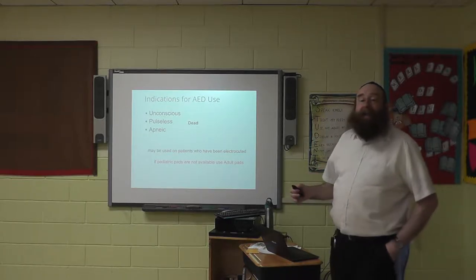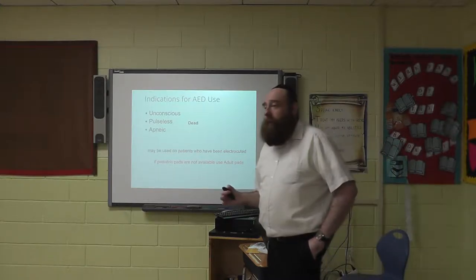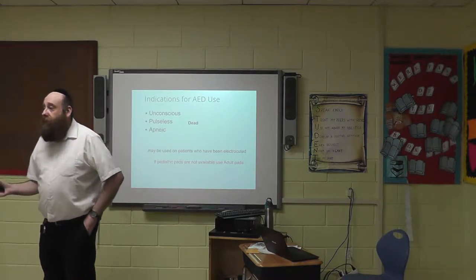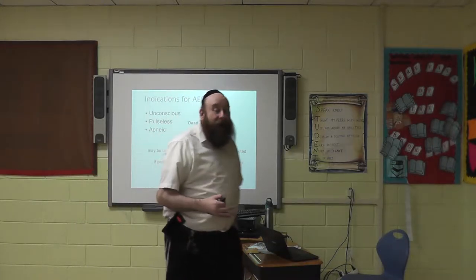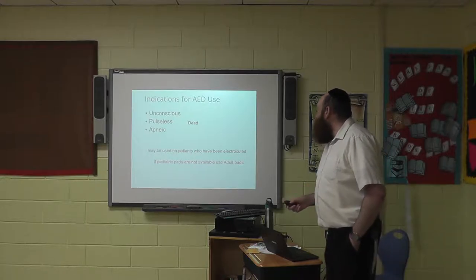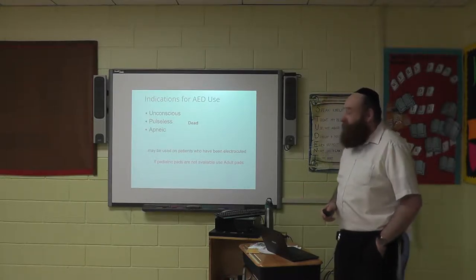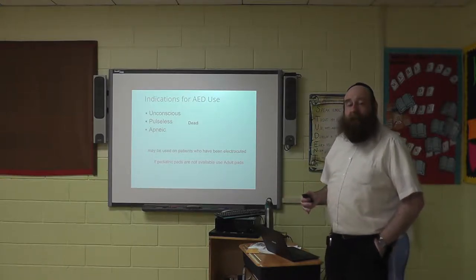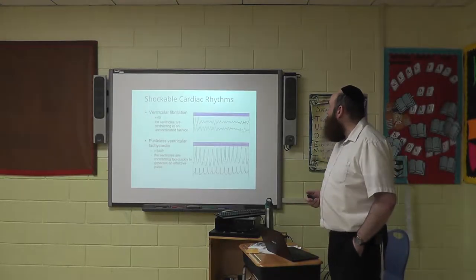When we use an AED, we come on scene, we find a patient who is unconscious, pulseless, and apneic. Not breathing. They are unconscious, pulseless, and apneic. They are dead. We can use an AED. This is something you often see as a test question, so I just stuck it here. If pediatric pads are not available, use adult pads. We'll talk about that more soon.